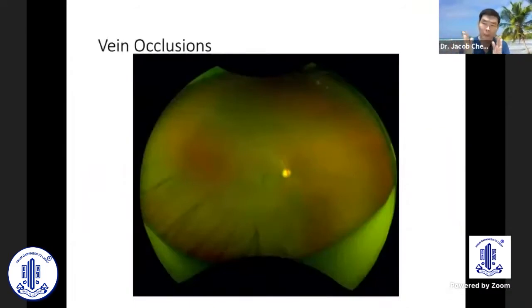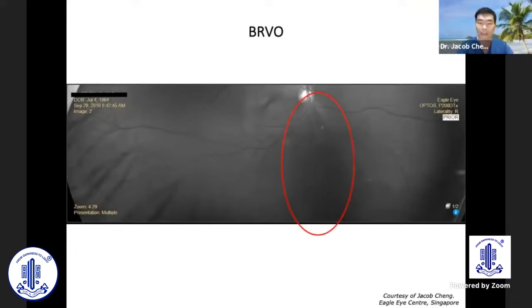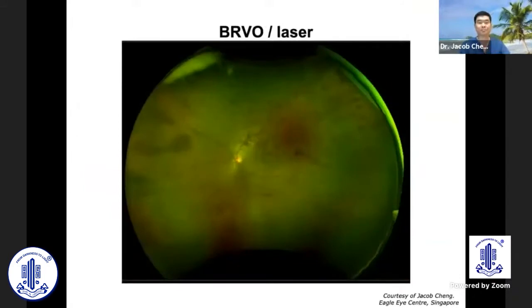But looking beyond the patient's complaint of the left eye, we image the right side as well routinely. Here, what do we see? Almost normal-looking retina, but you might just spot a sclerosed vessel inferiorly. So zooming in, you can see there's a sclerosed vessel inferior to this. In this asymmetric right eye, you can also see the darkening supplied by this retinal vessel. This wedge-shaped distribution will be manifested, enhanced, and highlighted on the green channels, as you can see here, where it highlights the retinal pathology better.